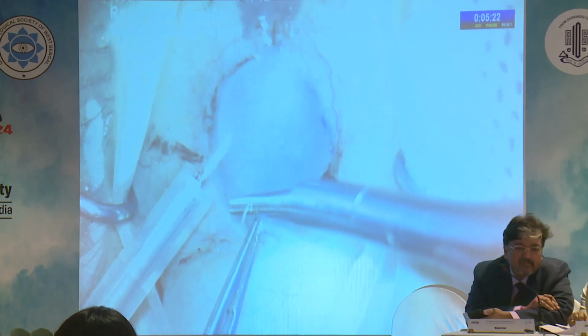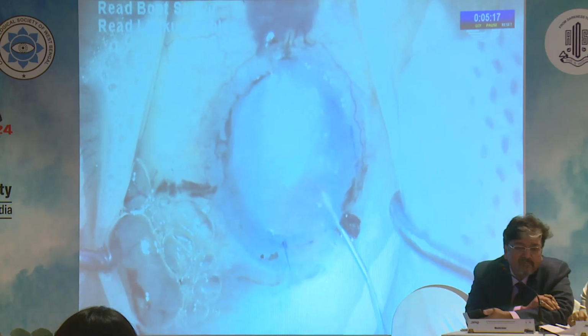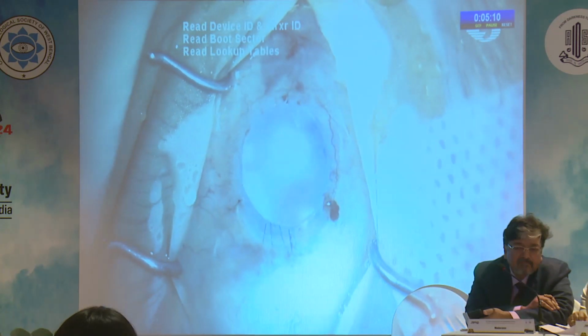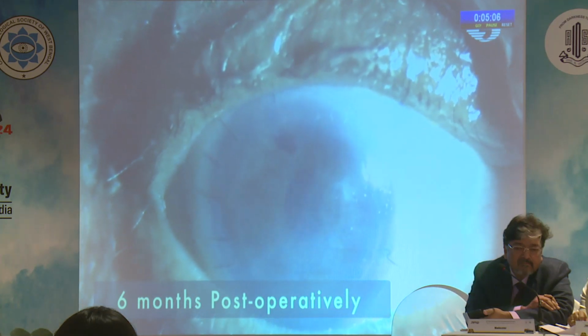Sutures are applied to the main wound and all the side ports, and air is injected into the AC to help attach the graft. At the end of the surgery, the graft is found to be well centered. At 6 months post-operatively, the graft looks clear with minimal scarring.